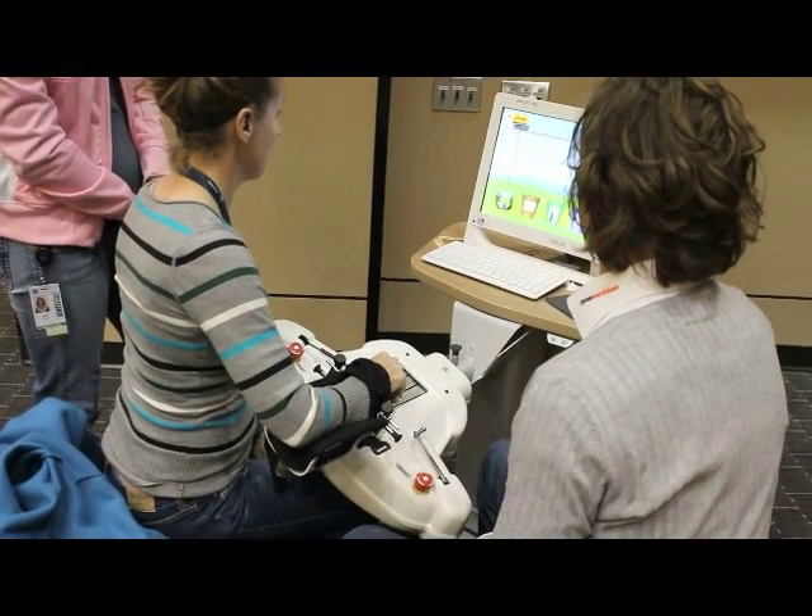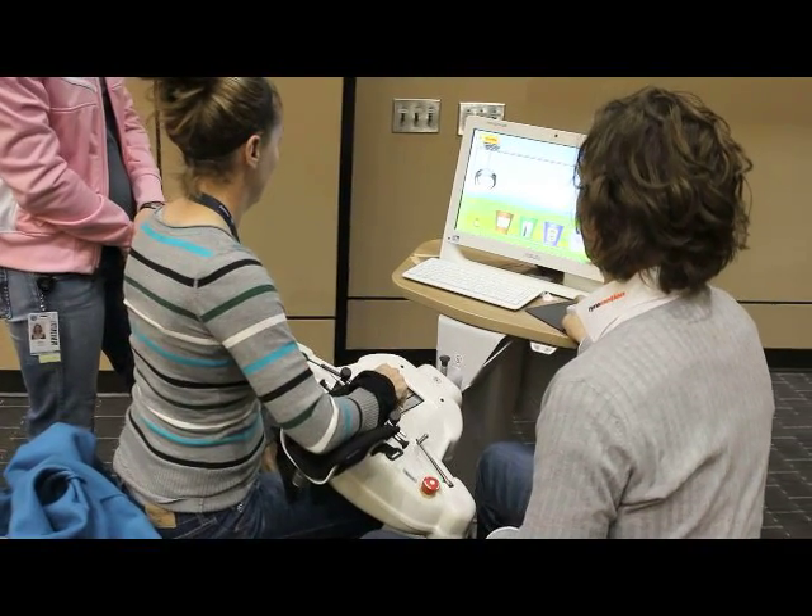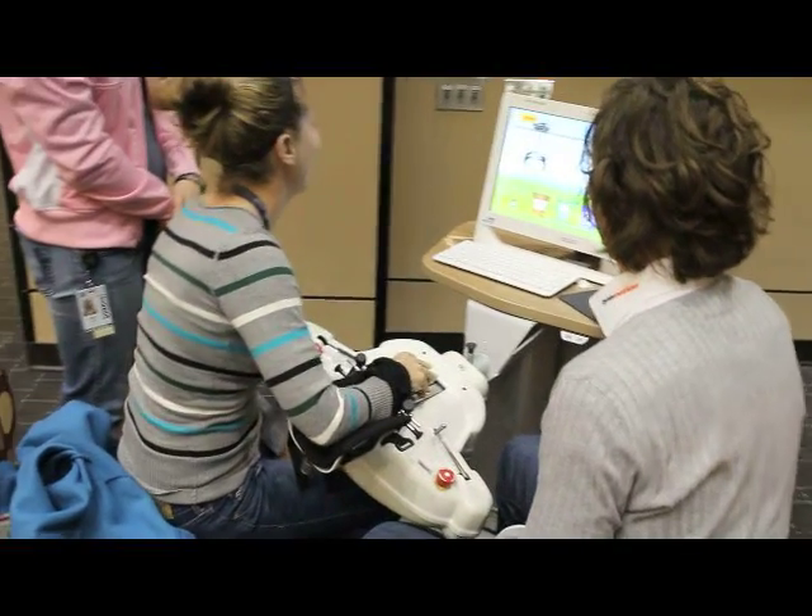It's kind of hard — it moves fast. It's level five already. Now you put the can into compost. Wasn't that a fish? No, it was a can of fish.